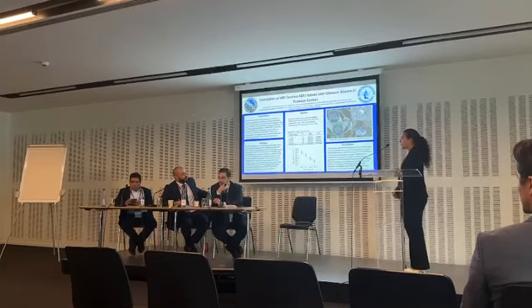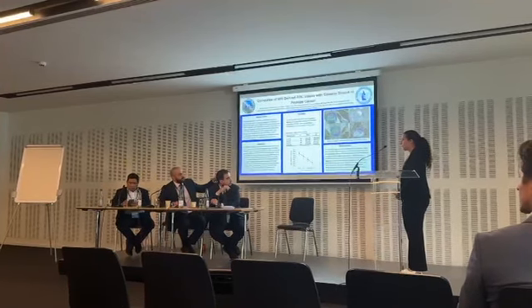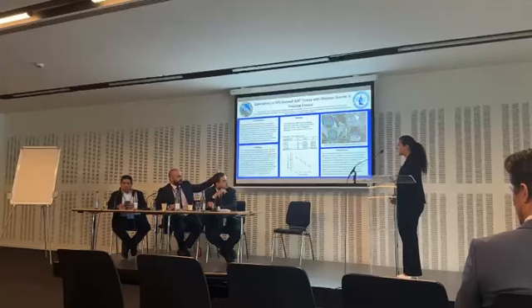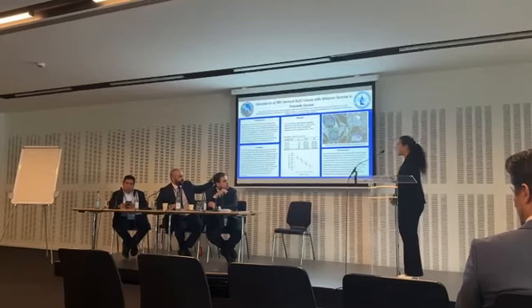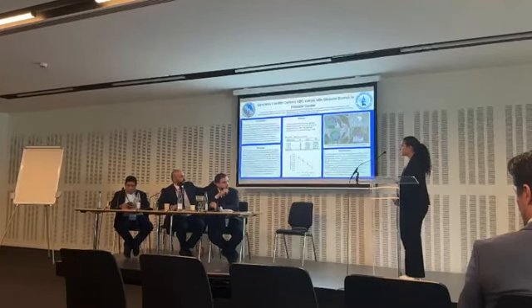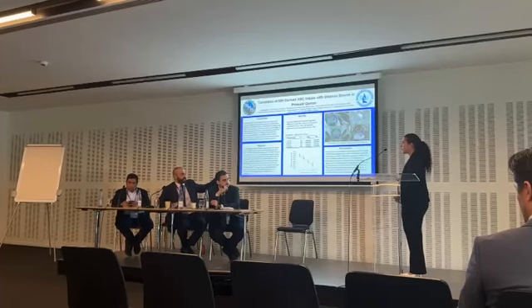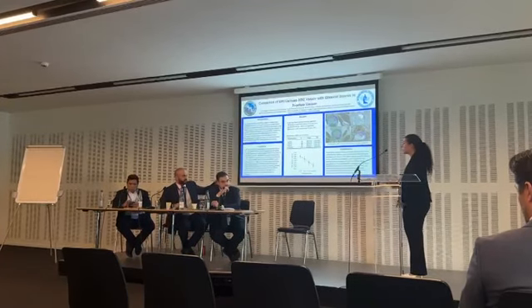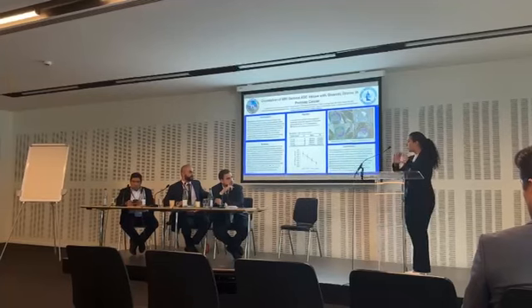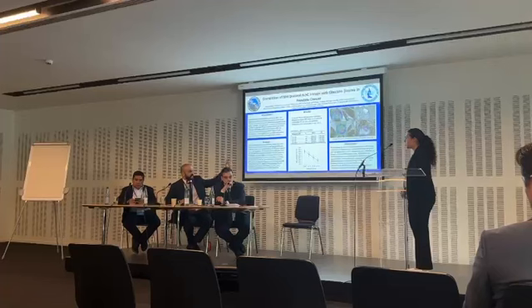Okay, it's a very nice study that low ADC correlates with a higher Gleason score, and I think that's based on biopsy. The biopsy was done and showed whatever Gleason it is. Was the biopsy MRI-guided, like a targeted lesion biopsy, or is this a Gleason score from a different lesion? It was MRI-guided biopsy, but the way that we do the biopsy is we did the standard one as well. But this Gleason score is actually from the lesion?